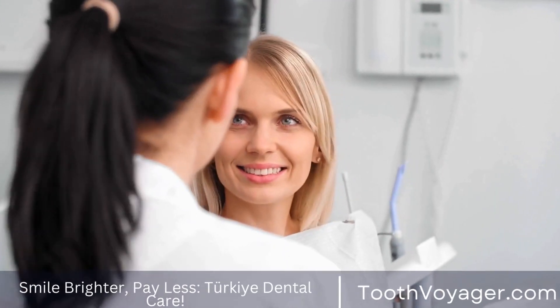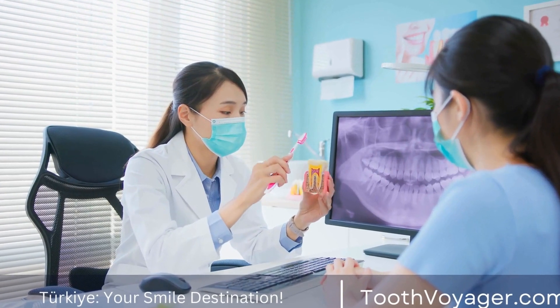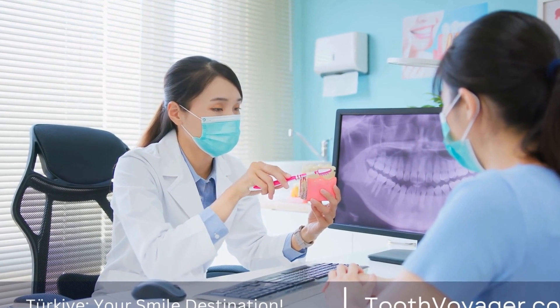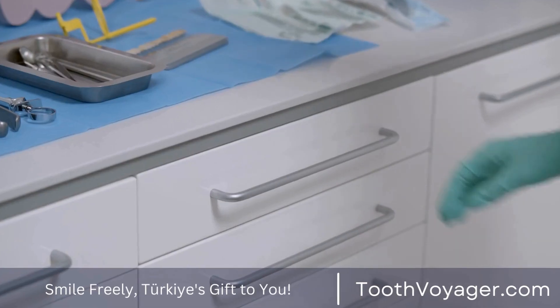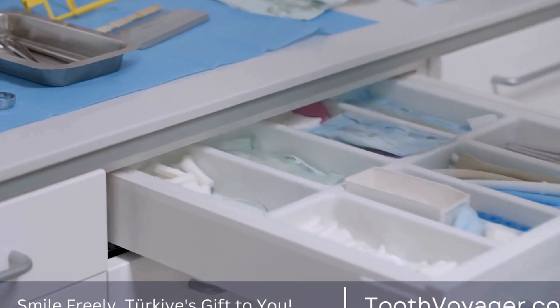Preparation: Before a crown can be made, the tooth receiving the crown must be prepared. This involves removing any decay or damage and reshaping the tooth to accommodate the crown. The dentist will then take impressions of the prepared tooth to create a custom-fit crown.